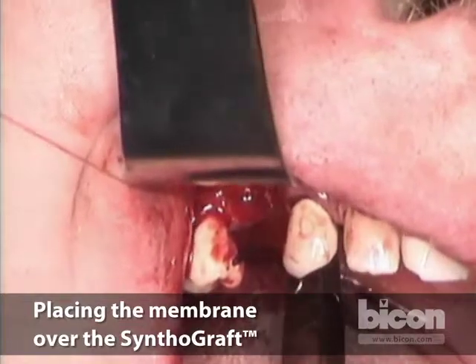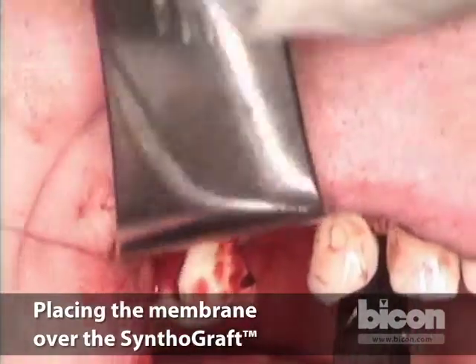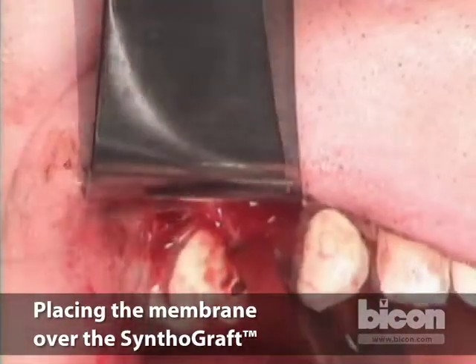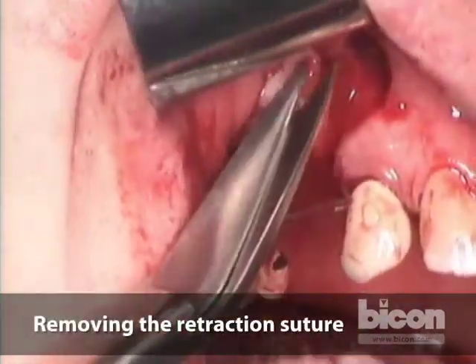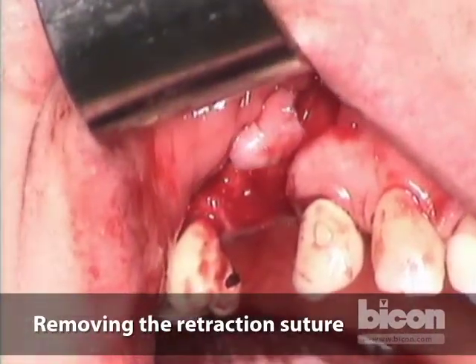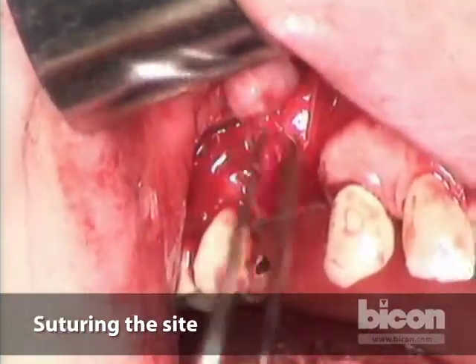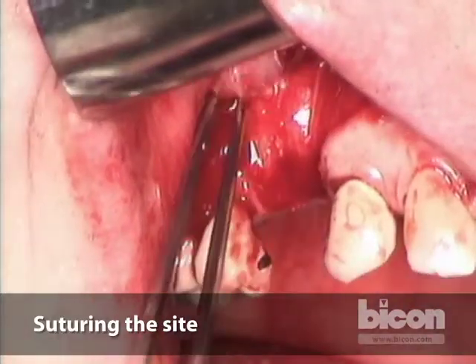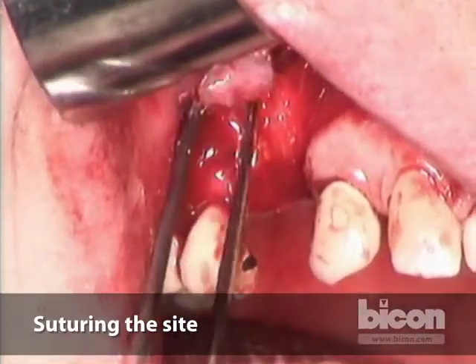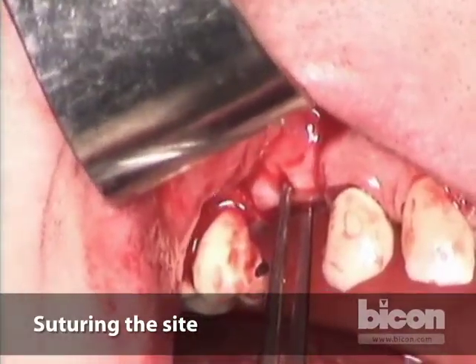So we're going to use a cinch knot instead of a square. 1, 2, 3, and 4 throws here. First of all, we will release our retraction suture. Pickups, please. Thank you. We want to make sure that our membrane is exactly where we want it to be, with the two sides of the retention suture straddling the implant. Okay? Then we want to pull this and see that it is closing with no tension.